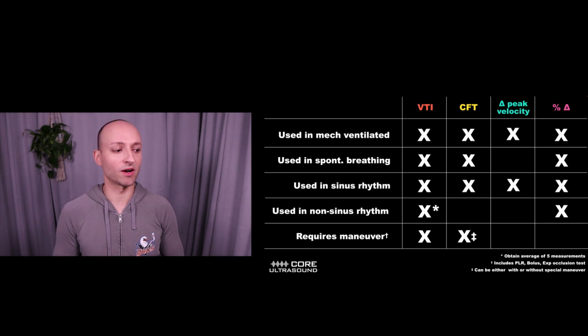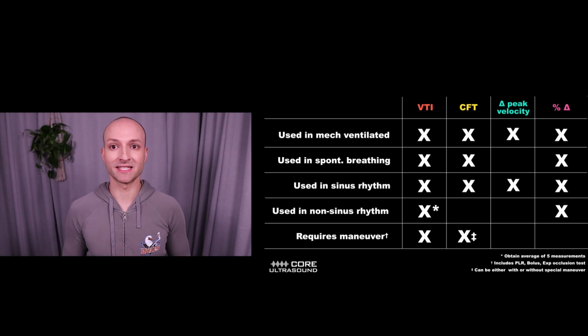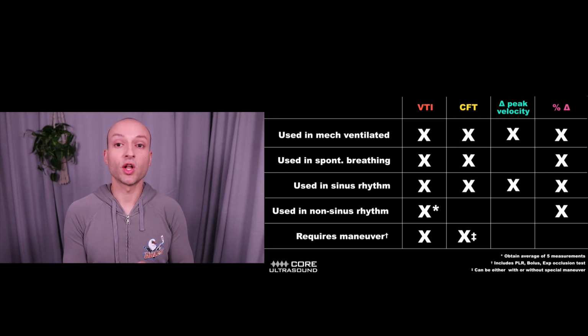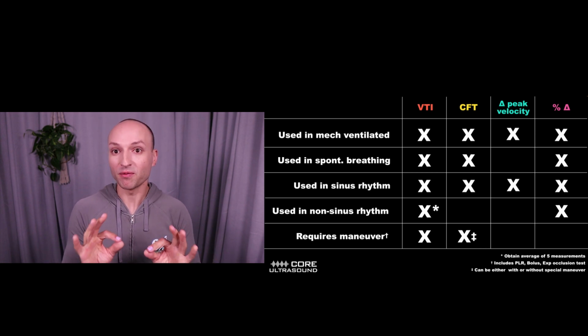One of the important ones is the fact that the ideal patient for volume responsiveness is somebody who is mechanically ventilated and not breathing over the vent. Their tidal volume is greater than 8, and they don't have an arrhythmia. That's the perfect patient, that's what you want.